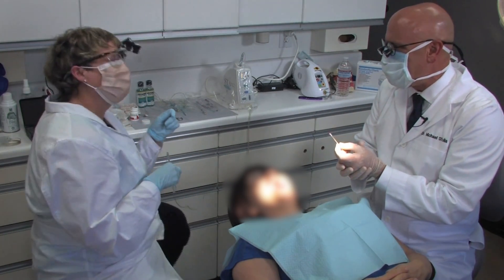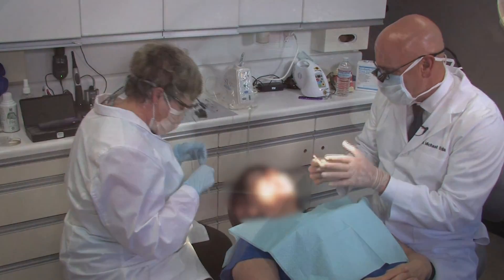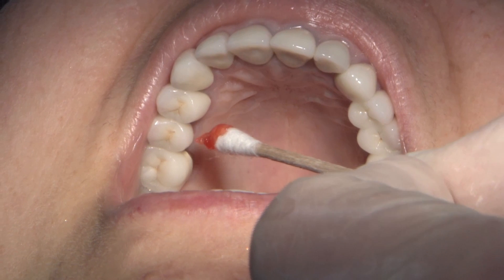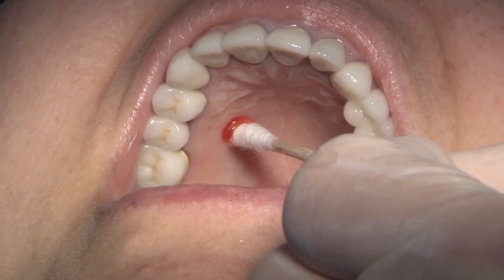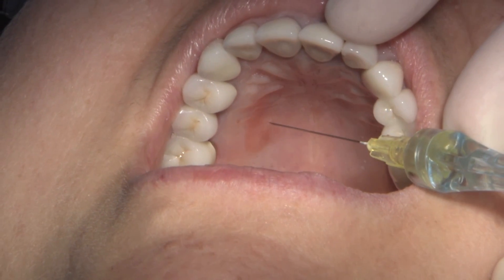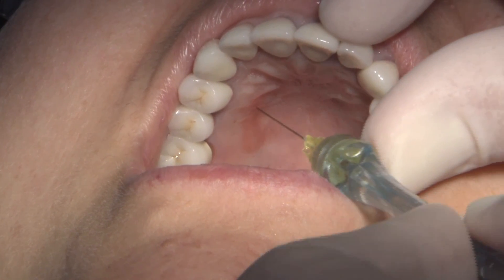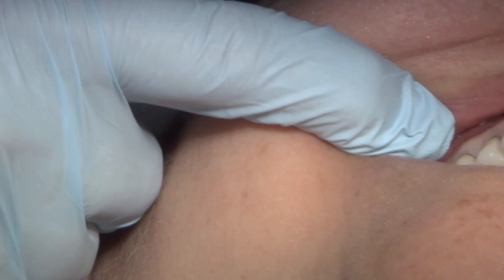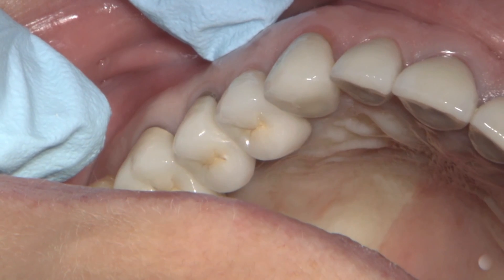As long as Kathy was here with my willing dentist participant in the chair, I asked her to teach me the anterior middle superior alveolar injection — the AMSA. Per her instructions, we're looking for where the curvature meets the flatter aspect of the palate, right in between the two bicuspids. We park the bevel against the bone so the bevel is right against the bone, and you can see the blanching from the mesial of the second molar through to the first bicuspid. That made me feel powerful!